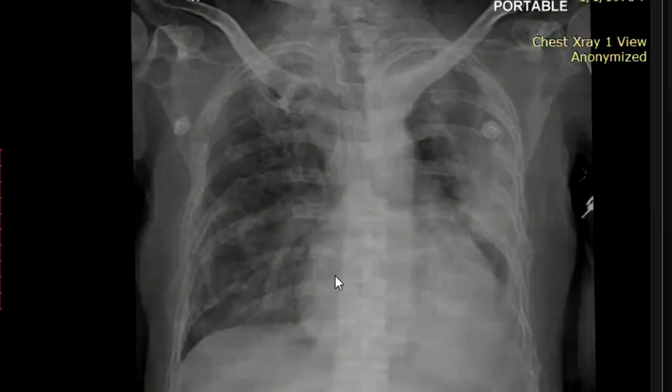Mediastinum is shifted towards the contralateral side. Cardiac size appears to be enlarged. Left CP angle is blunt. Right hemithorax also shows multiple expansile lytic lesions within the ribs, in the right fifth or sixth rib. The rest of the bones, clavicles, and shoulder joints appear normal.